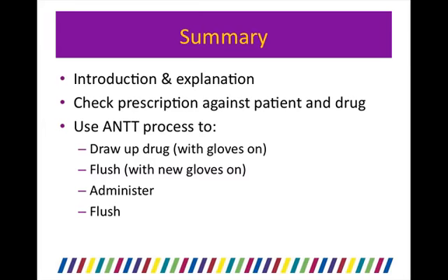So to summarise, introduce yourself and explain what you're going to do, check the prescription against both the patient and the drug you're going to deliver, and then use an ANTT process to draw up the drug with your gloves on, change the gloves, and flush, administer the drug, and flush again.